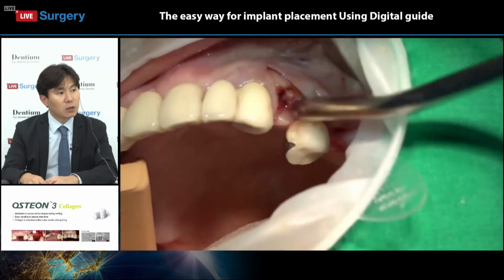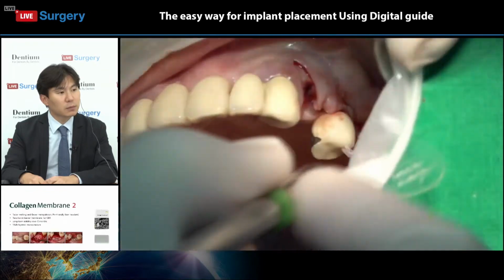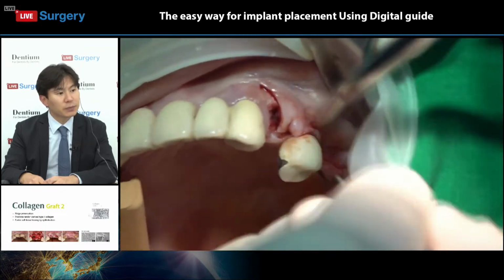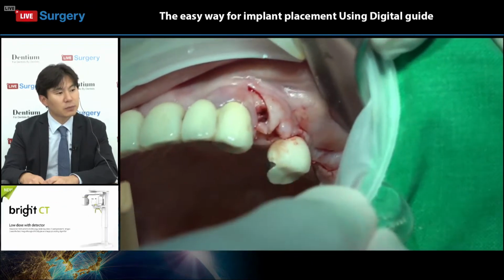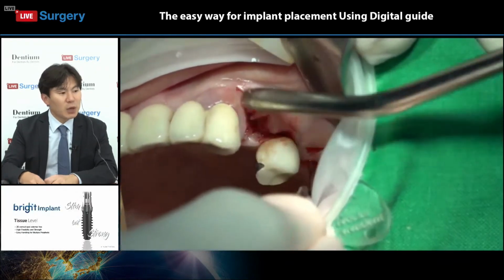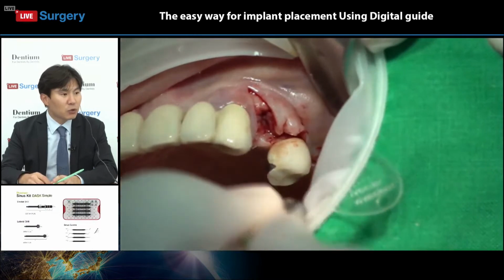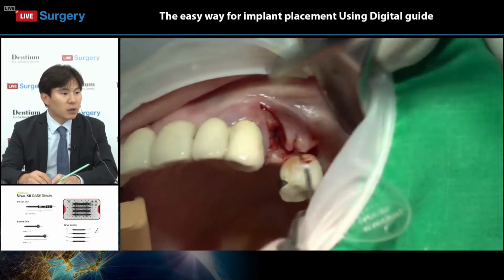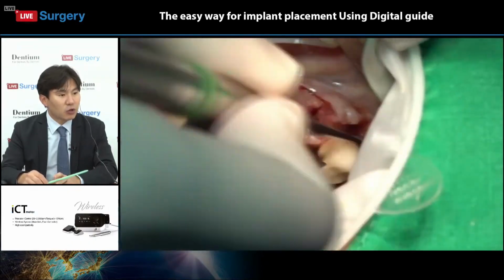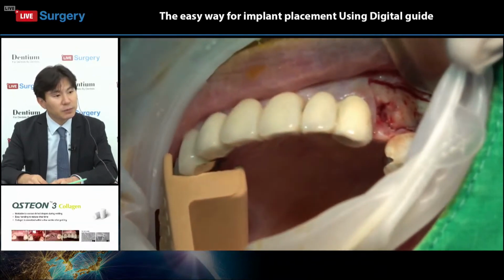We can see the socket area having some granular tissue. Sometimes the distal surface of the crown is a bit hard to get a clear cut. So I think that's why he used thread to cut the old fiber on the distal surface of the crown.